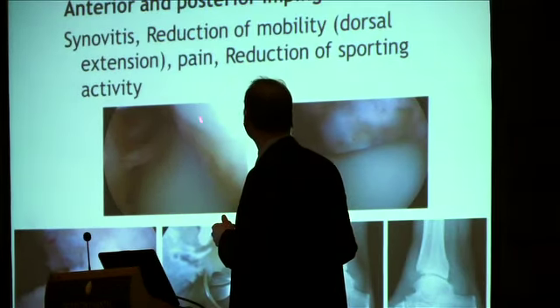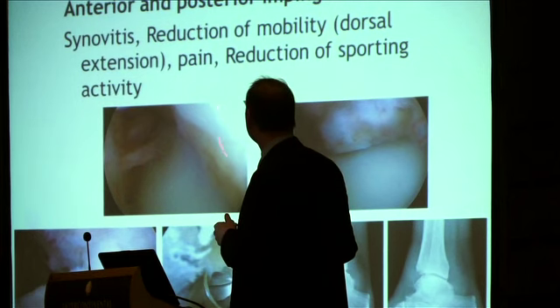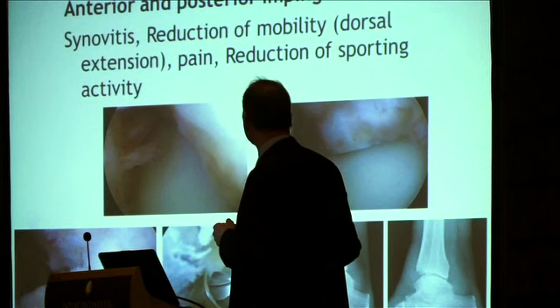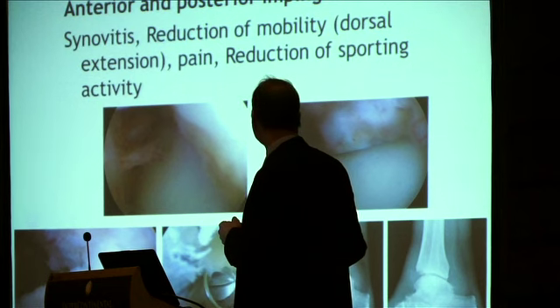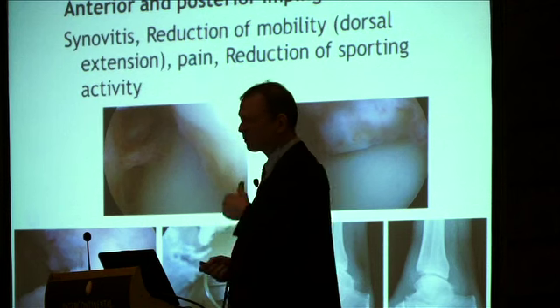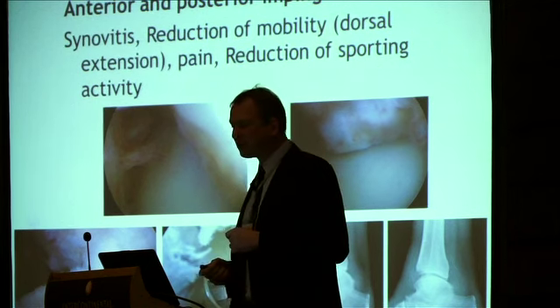You can see here the same situation: the tibia, talus, and synovia. You see these osteophytes here, and we can remove them by different techniques. Here you see it with a burr, and then we have a situation, as you can see here in the lateral X-ray view. Here's the osteophyte, and here we could remove the osteophyte, and then patients should have a better range of motion.